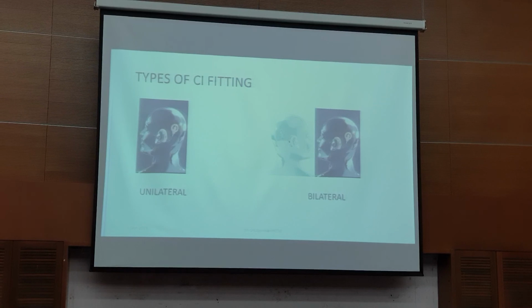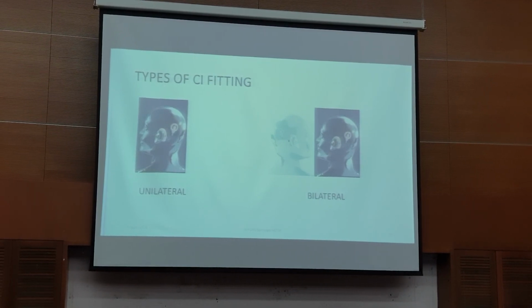Not only those with a really dead ear. Do you know what a dead ear is? Does anyone know what a dead ear is? We call it a dead ear if you don't get any response across the test frequencies. We should expect at least low frequencies, because of vibration, isn't it? But we don't even see that, despite assessing at the very maximum level on our audiometer. So we call it a dead ear. You have to be careful if you get such a case, because you need to do further investigation to see why there is no response.